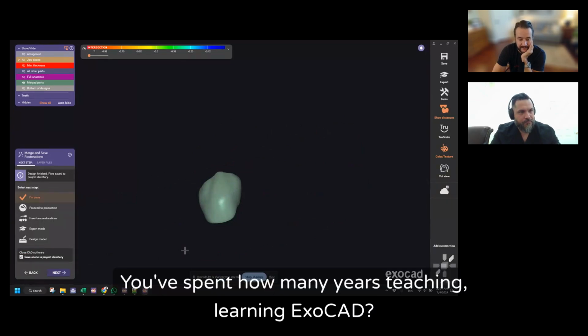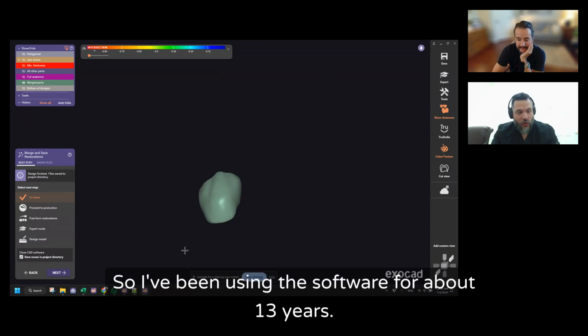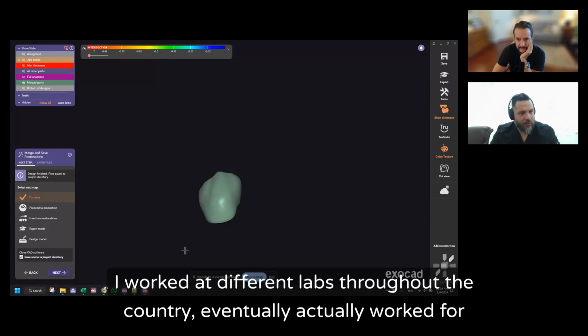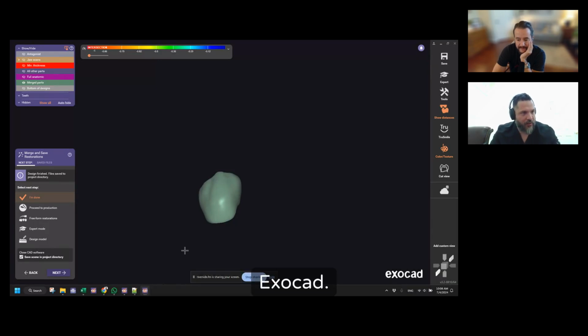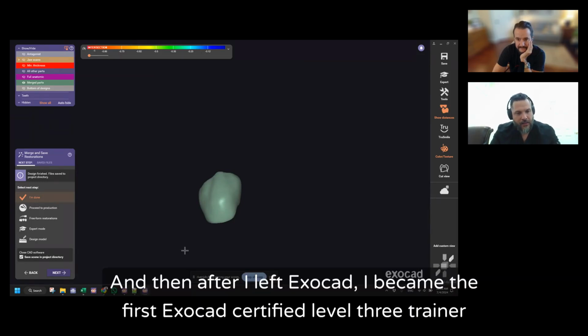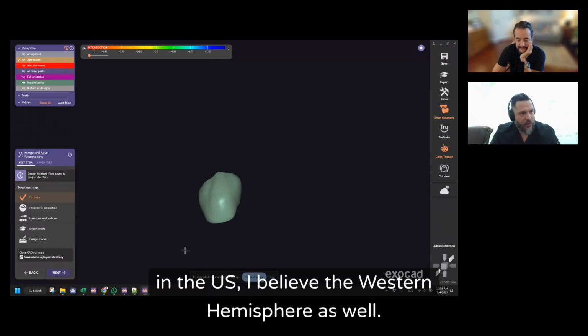Daniel, thank you. You've spent how many years teaching, learning exocad? I've been using the software for about 13 years. I started working on it with the first exocad distributor in the US. I worked at different labs throughout the country. Eventually, I actually worked for exocad. I did all their tech support and training for the entire Western Hemisphere. And after I left exocad, I became the first exocad certified level 3 trainer in the US, I believe the Western Hemisphere as well.